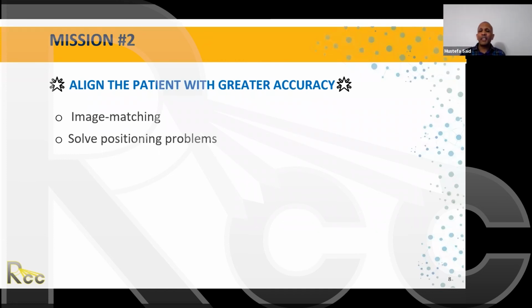Again, like I said, you cannot rush this. If you have a perfect setup, perfect cradle, perfect mask at the simulation, it's going to play out pretty good. You have a patient, you do the scout, you scan. You made a cradle, for example. You scan, you look and the patient is crooked. You go there, you move the patient, then you scan. But when you move the patient, you probably create some kind of gap in that cradle. If you move your patient, go back and reform your cradle, because the next day the patient comes, they are going to lie down the way it is formed. So take your time and give the patient a perfect setup.